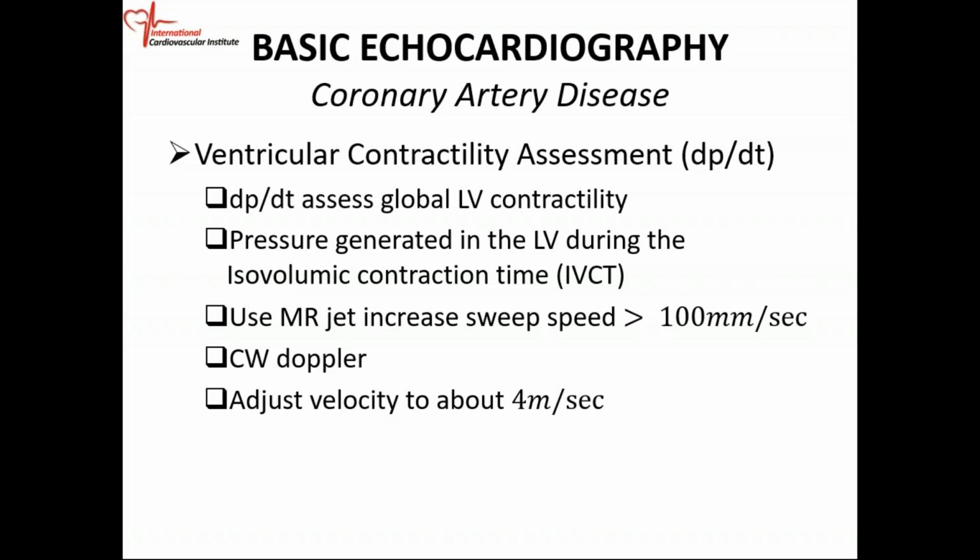Okay, so the ventricular contractility assessment: basically, you're seeing how well the ventricle is contracting. So you're looking at the change in pressure with time. For a normal ventricle, you're going to visualize this now.